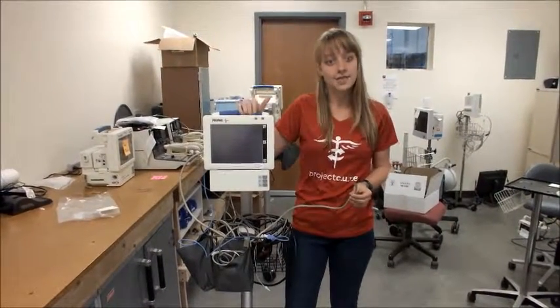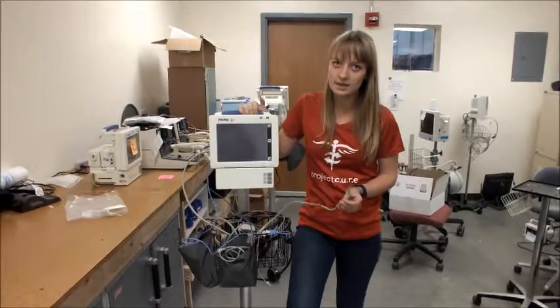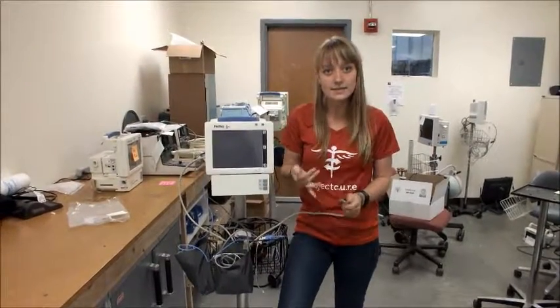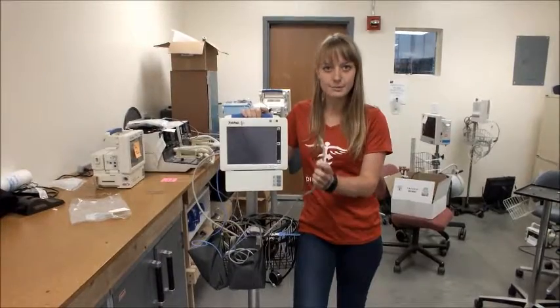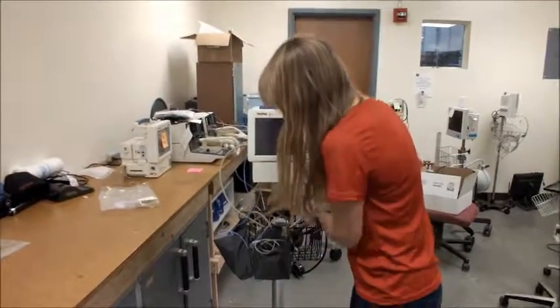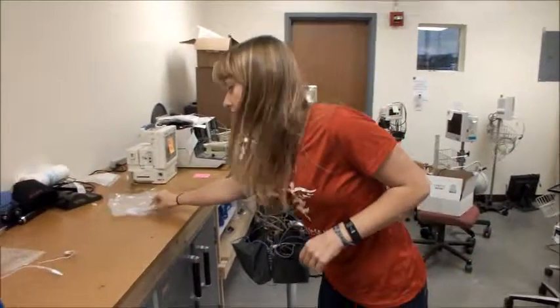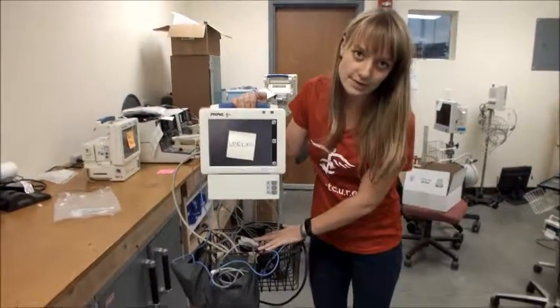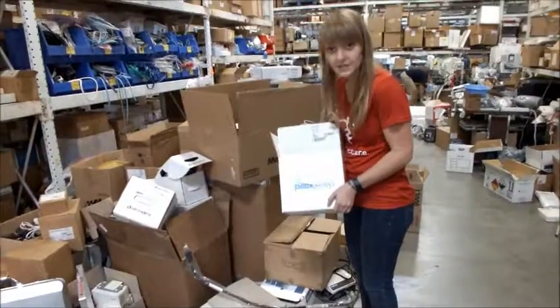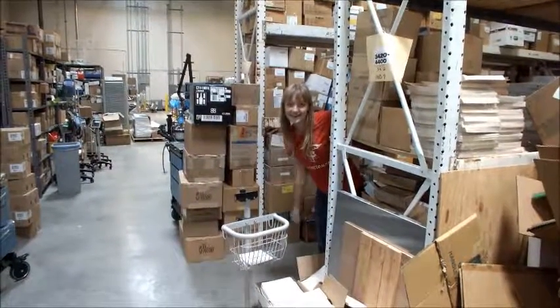Once you've done all of your tests — SpO2, blood pressure, temperature, and EKG — and none of the tests failed and you don't have any broken or missing parts, then you're ready to send this machine to be cleaned and packaged. Remove the blood pressure cuff and bottle from the blood pressure tube and take the temperature probe off the temperature cord. Then put a sticky note that says working on the front of the machine so they know it's been tested. Take the whole machine with the cords you used and send it over to be cleaned. You can place your device there if it's working and ready. Way to go — now you're an expert EKG tester!